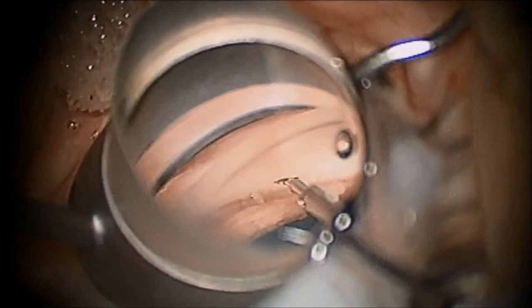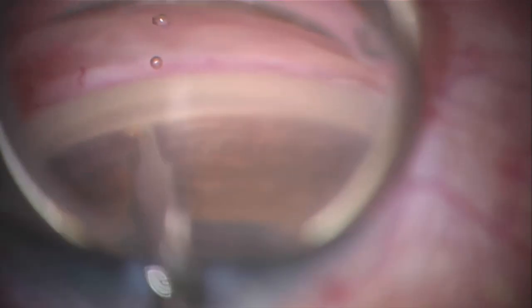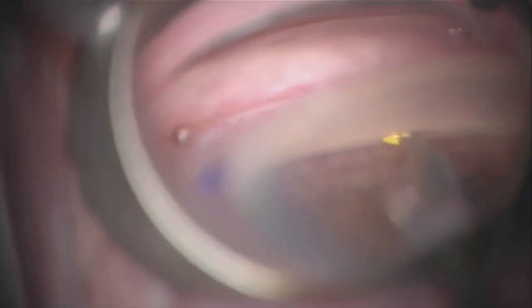If this occurs, stop, remove the tip from the canal, and reposition and restart as often as needed to get a very smooth advancement and ablation of tissue. There should be nearly no resistance of the Trabectome tip as it safely removes the strip of trabecular meshwork.